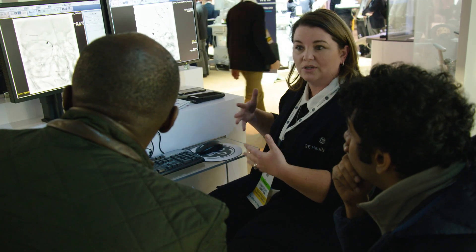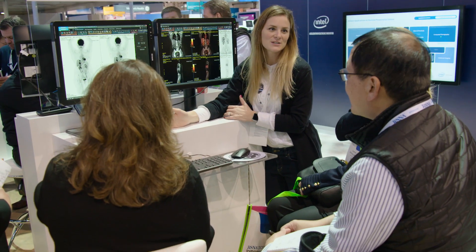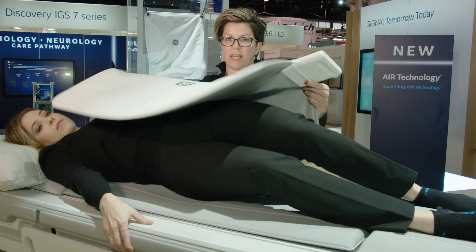Each patient, even if they've had surgery and can't lay on their back and have to lay on their side, we need to have an option to scan them with optimal image quality and make it adjustable for everybody. What we're doing to address that challenge is having light and flexible coils that lay directly onto the patient.